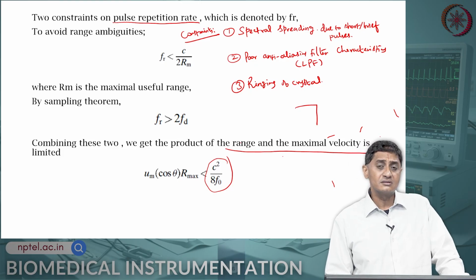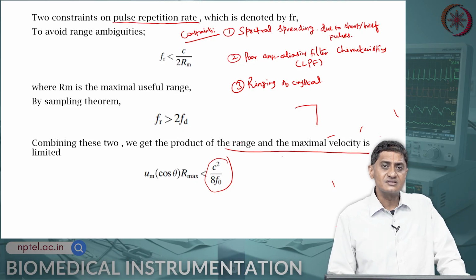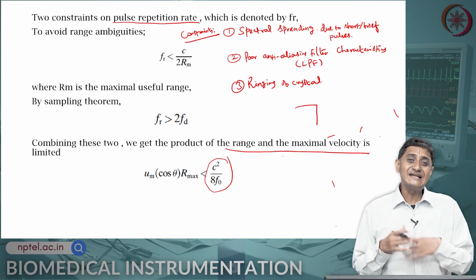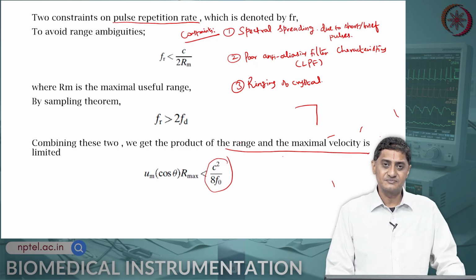You could reduce the Q factor by artificially adding a mass to the oscillating crystal, but if you reduce it too much, there is a general inefficiency built into the system, which is not favorable.